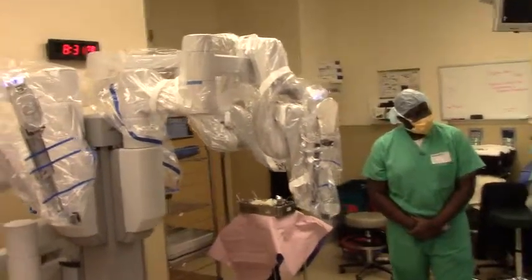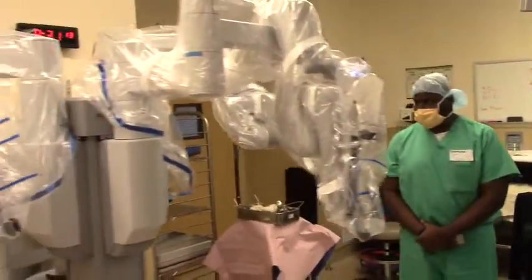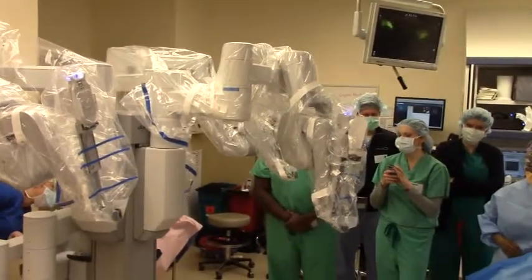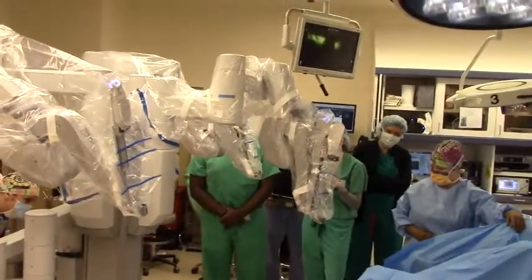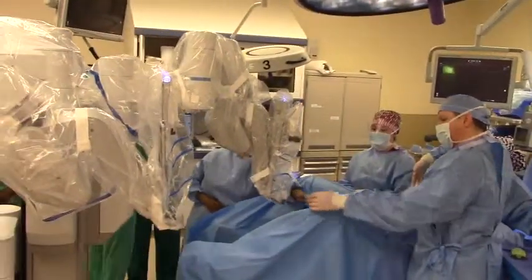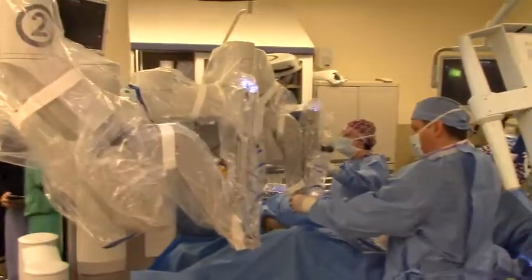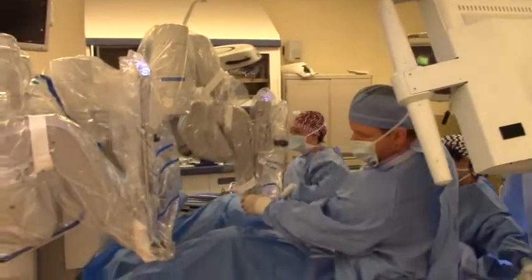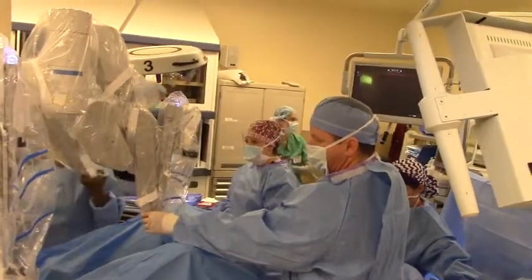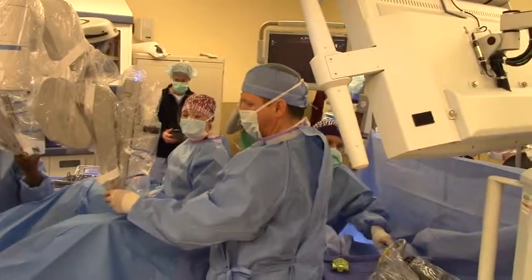So if you want to come around, let me just show the robot real quick. It's essentially your side docking.